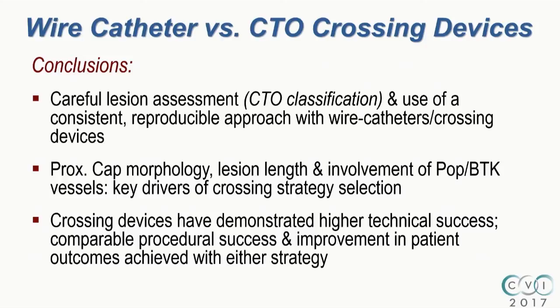What you see amiss here is the absence of calcification, because I do believe there are no good calcification solutions. Finally, although crossing devices in one single study from our group demonstrate higher technical success, I do want to reiterate that we can achieve comparable procedural success and comparable improvement in patient outcomes with either strategy.